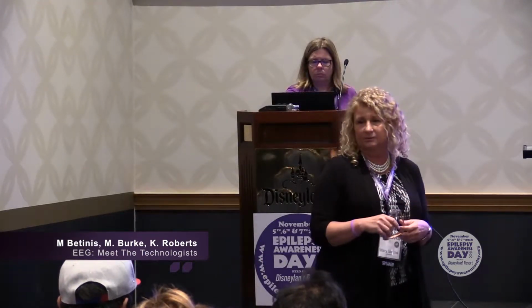And then we will have a neurologist or an epileptologist review that study, whether it be an hour study, 24, 48 hours, 72 hours. They will go through all of that, and then they will formulate an interpretation or a description of that EEG and then provide that to the referring physician or your partner of care.